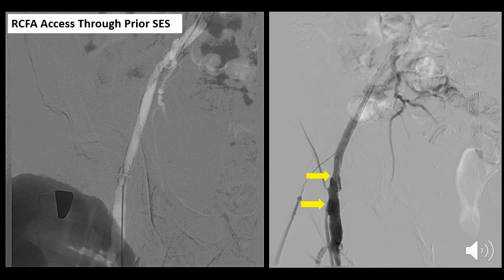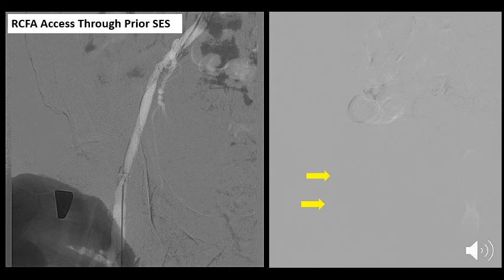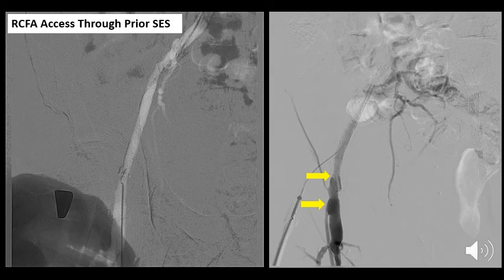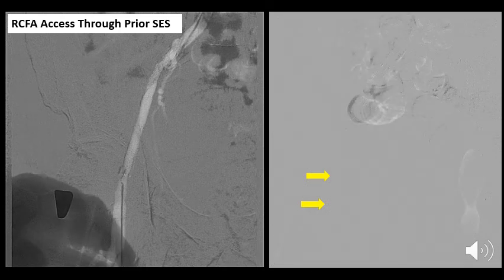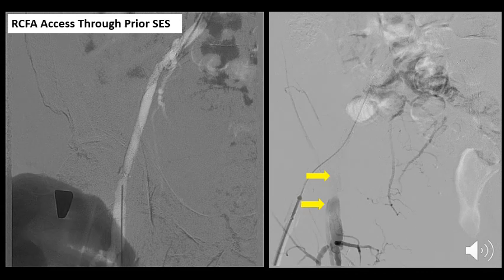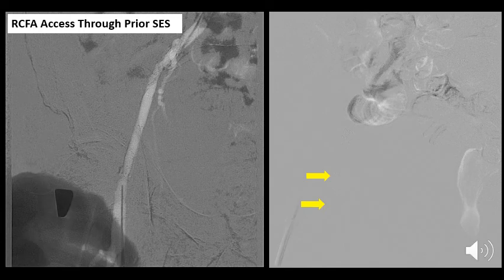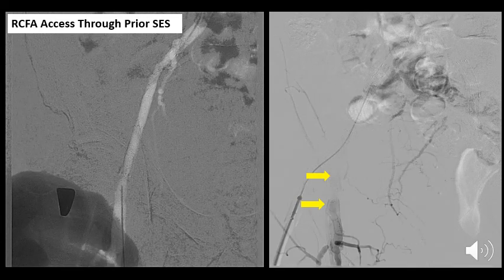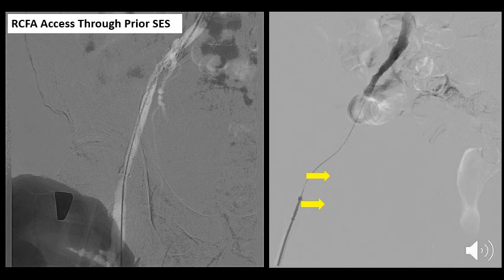and the distance between them is the area that is probably the best site for a vascular access stick. However, closure of that area either with Perclose or with Angio-Seal or other devices could grab at the origin or distort or disturb the origin and flow into the graft. And therefore, we actually made a decision to stick through the stent that was slightly at the top of the femoral head.